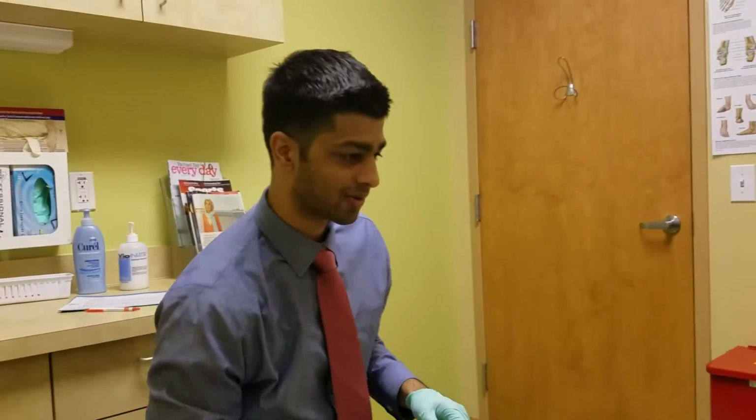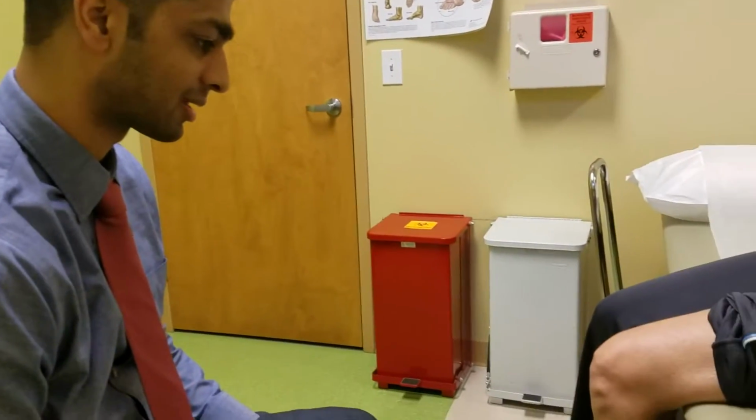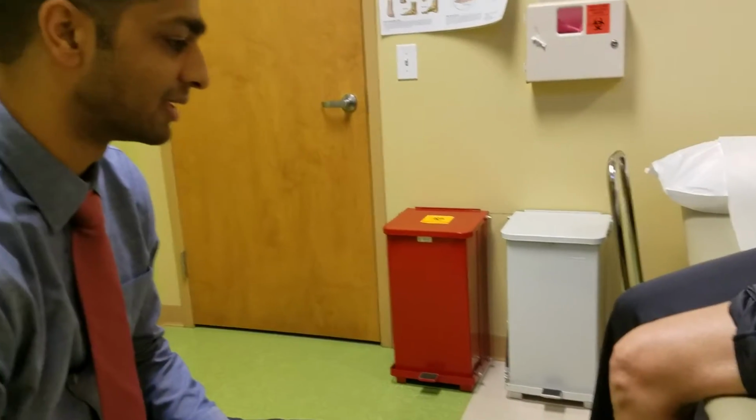Okay, so we are going to do a left knee hyaluronic acid injection as number 3 of a series of 3, and I'm going to be doing it through the anterolateral portal of the knee. There's multiple ways you can get into the knee. I just choose to do this because of ease of positioning and ease of getting into the joint.